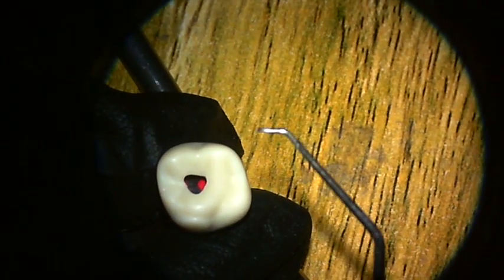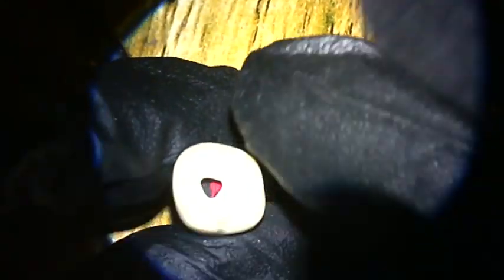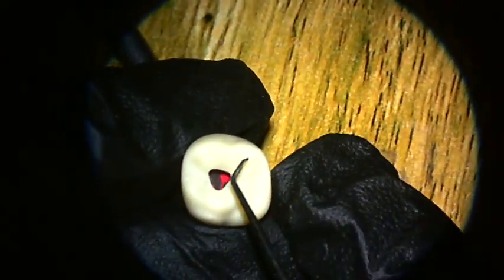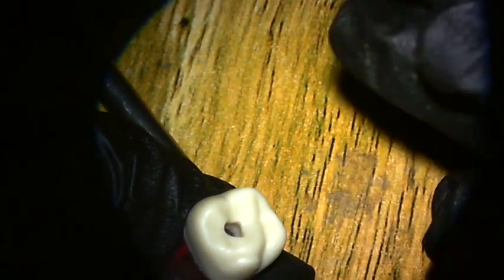Now, using the straight end of my sickle probe, because I don't have the small straight probe that the ADC is providing, though any probe will do, you pass it from the orifice upward. If there is a catch, please note that when you're doing this step, you must not use high force.